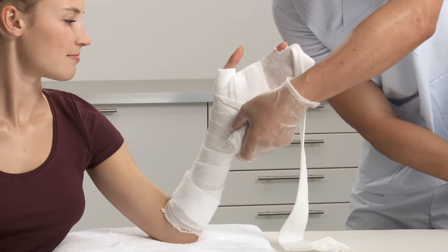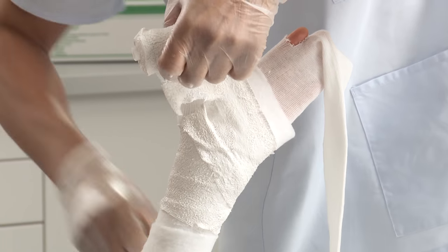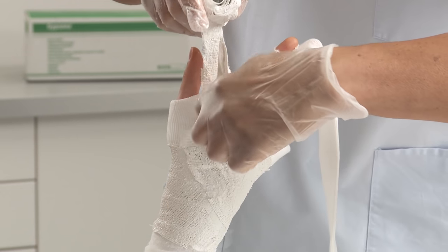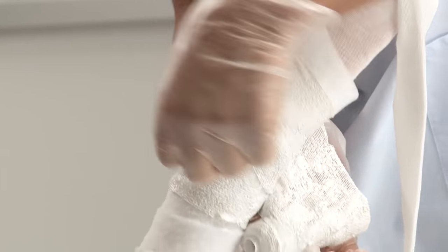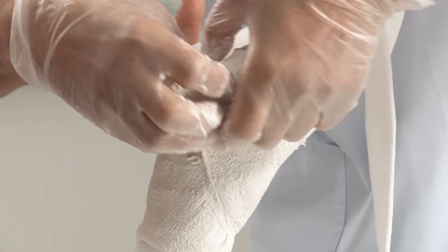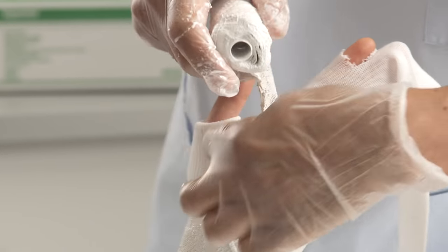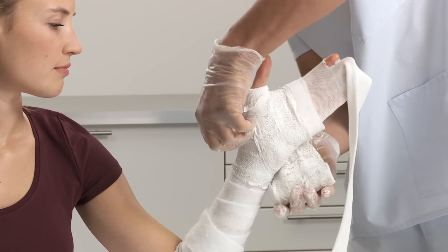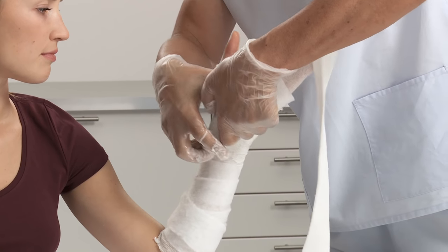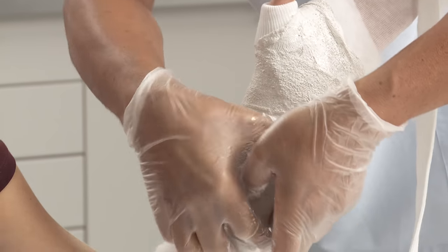Going distally, start applying the plaster of Paris bandage from the wrist. Make a cut at the thumb to easily pass through the web space — do this twice. Apply with 50% overlap towards the elbow and cut.